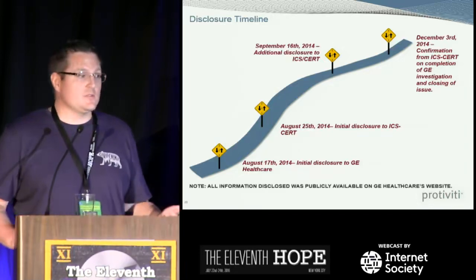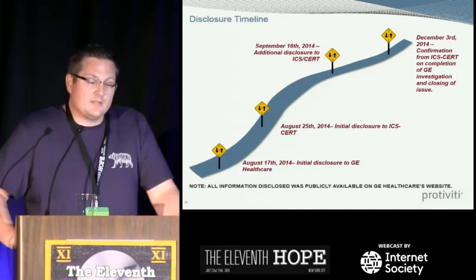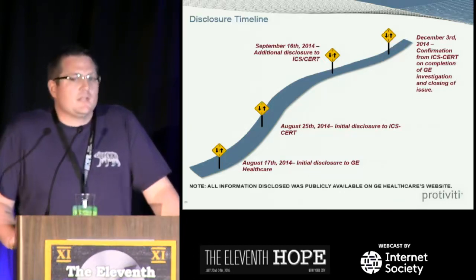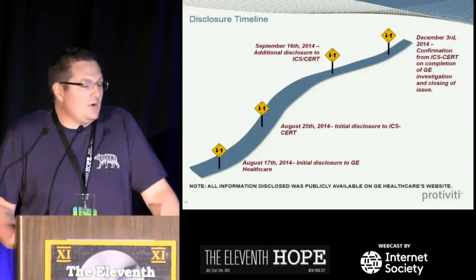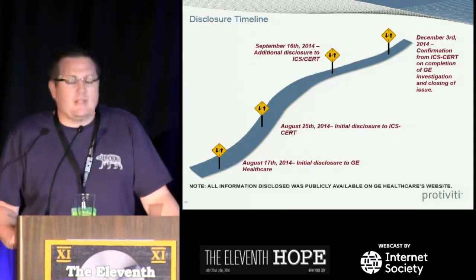So we did find that also. I focused on this hospital scenario, but we did find directly connected devices. And so then we said, okay, we have vulnerable devices directly connected, or there's lots of hospitals that have misconfigurations in their system that allow direct access into these medical devices. Well, how hard is it to get remote admin access if that's the case?